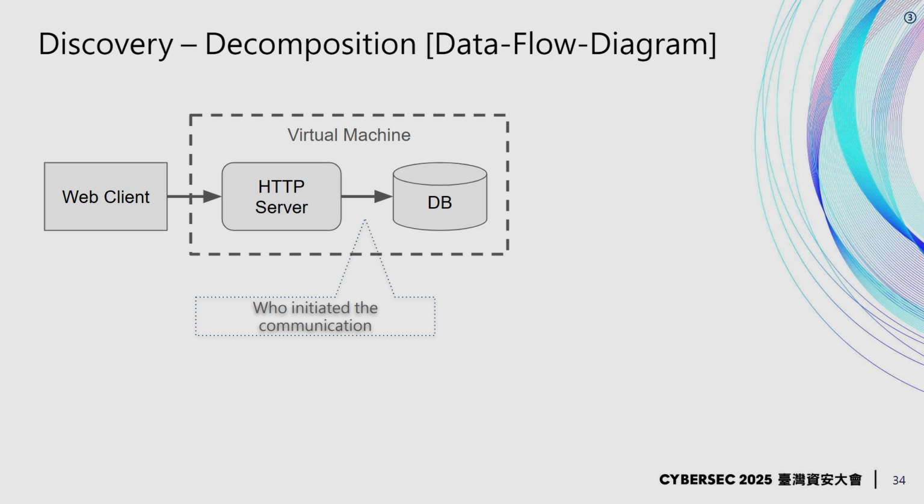And then the second element I want to highlight is the trust boundary, right? This box around there. Usually the trust boundary means the components within are trusting each other. They don't need to perform authentication or some advanced control. But nowadays, we want to optimize that and go toward a zero trust design for your software and system. So ideally, we always want to enable authenticating and validating the other components and not rely on trust zones.